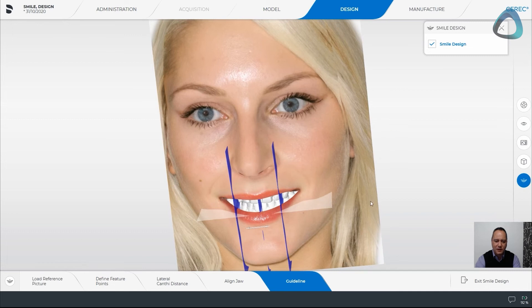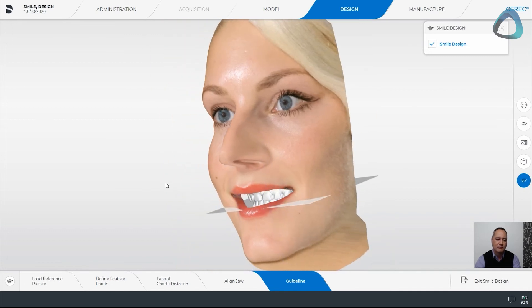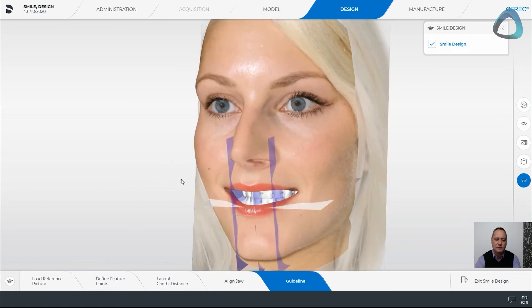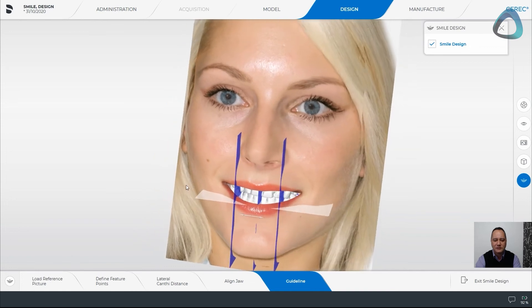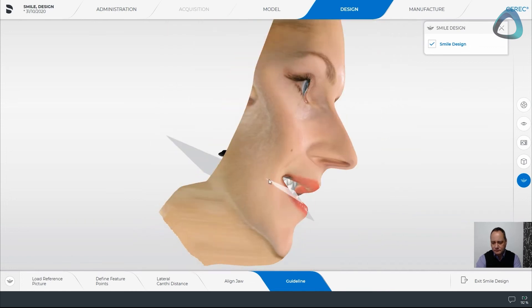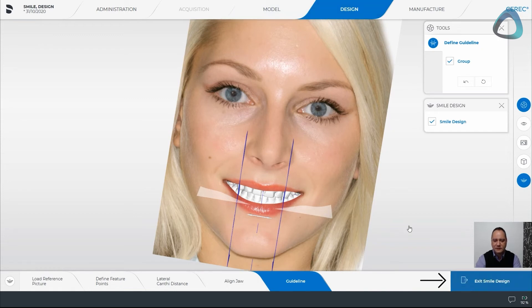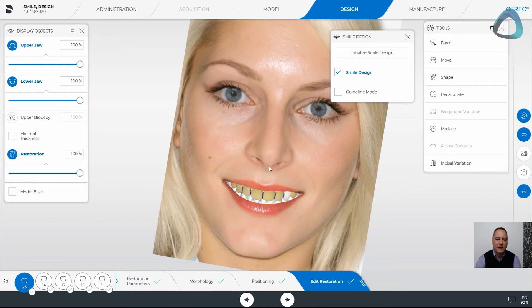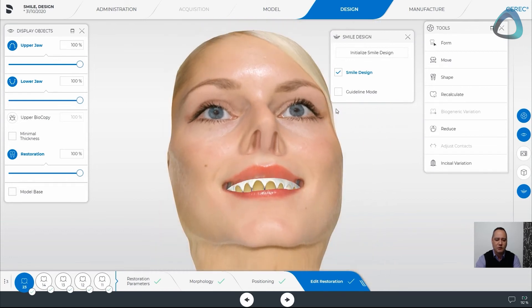As I rotate us around, we're now getting a two-dimensional image that becomes a wrapped three-dimensional image to give us an idea of where the lines are sitting. If we go back into our design, we can exit the smile design. We've finished the setup and we now have our patient in view, which we can move around and look at the design.